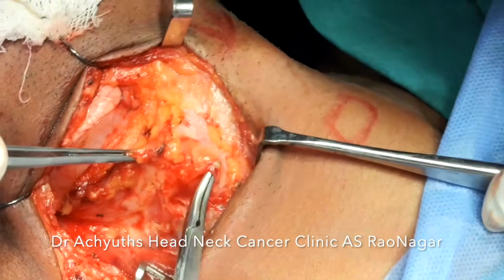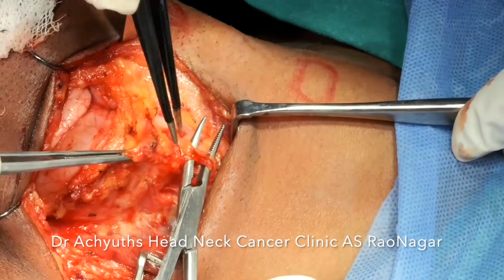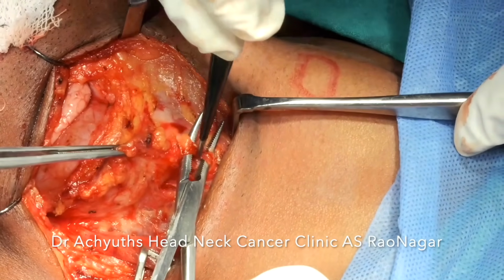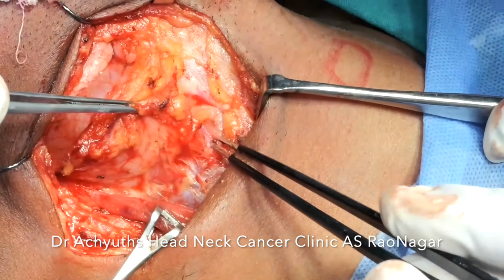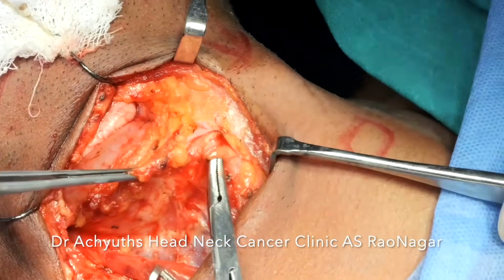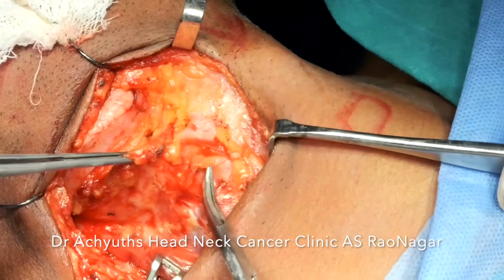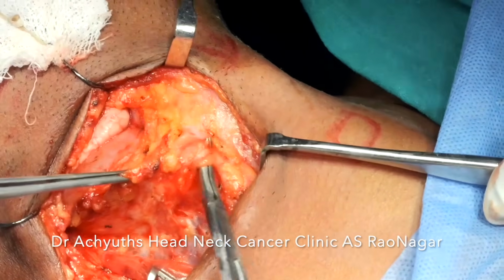We should also understand that since on the scan we have seen that there is also an internal component which is attached through the thyrohyoid membrane, we know that the rate limiting factor here will be on the medial surface. So once we divide it inferiorly, superiorly and laterally, then we can work along the medial side.